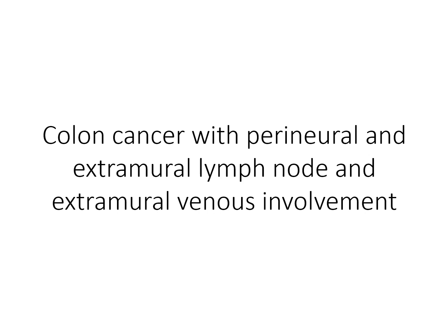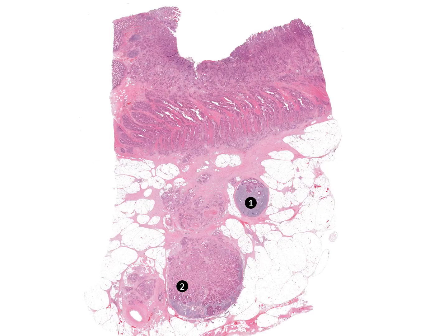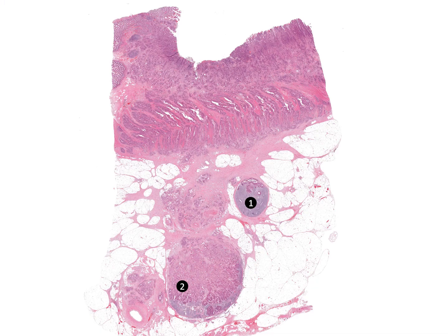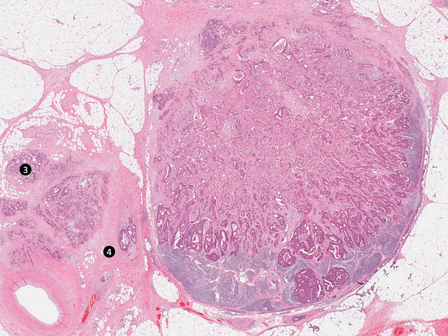This advanced colon cancer shows the adverse prognostic features of perineural and extramural lymph node and extramural venous involvement. In this lymph node, tumor is mostly in the subcapsular region with more limited parenchymal involvement. In contrast, this lymph node is almost entirely effaced by tumor.